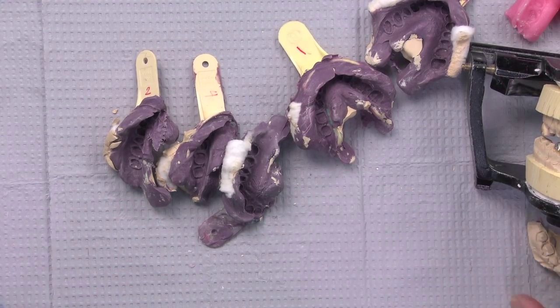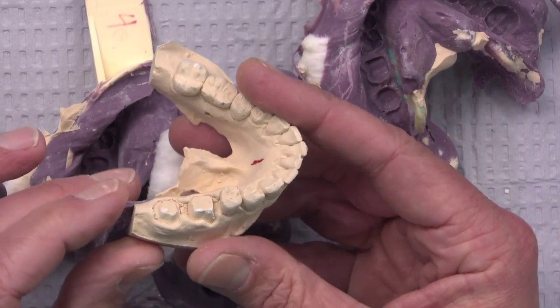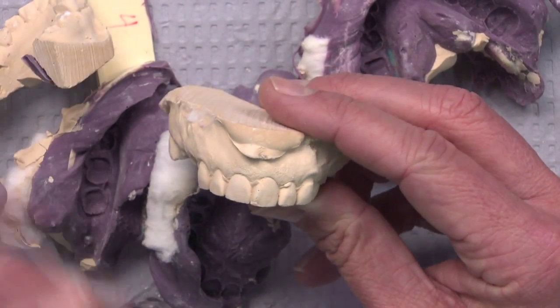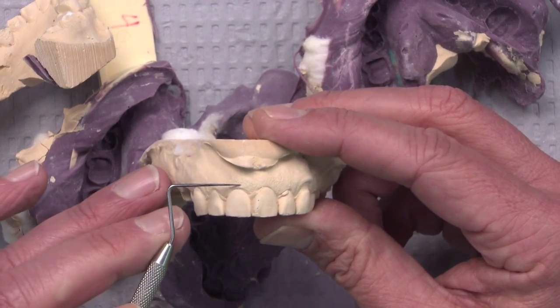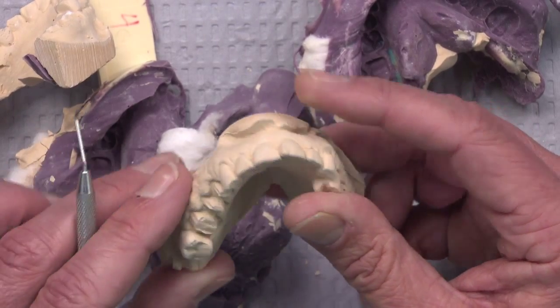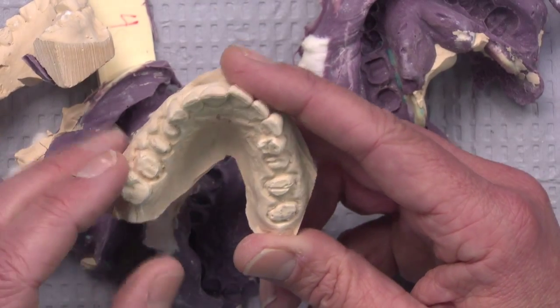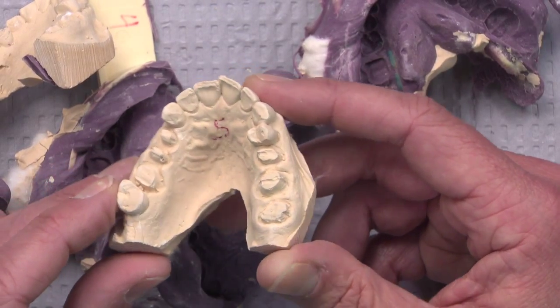And you can just go in with that laser and just zip around the teeth and trough those teeth. It removes some tissue while you do it, but that's really not a big price to pay in the posterior. When it comes to anterior teeth, I'm much more hesitant to use laser troughing in the anterior, because as you go in, this tissue is so thin right along here that as you go into trough in that area, you actually lose some height, and I re-expose my margin again. But teeth like these 3 teeth and these 3 preps over here, just grab that diode and go in there and just remove that tissue. As soon as you remove that tissue, it looks like you were using the 2 cord technique, because you've got a wide open sulcus where you almost can't help but get a great impression.